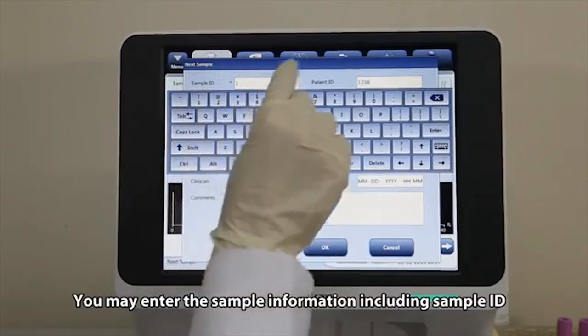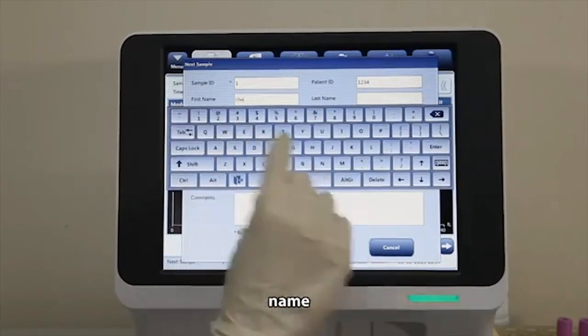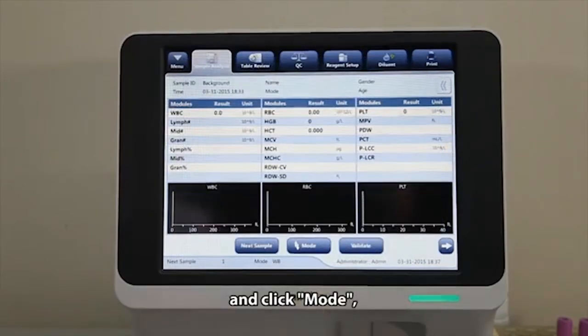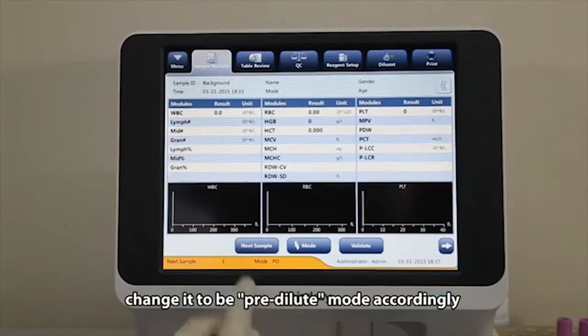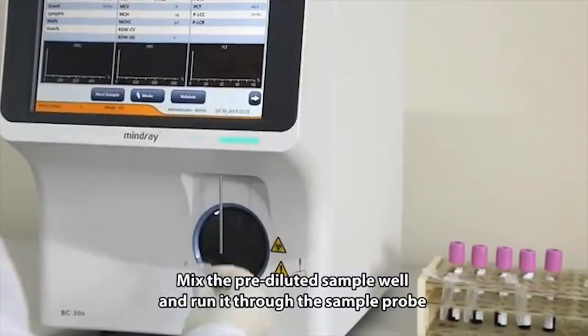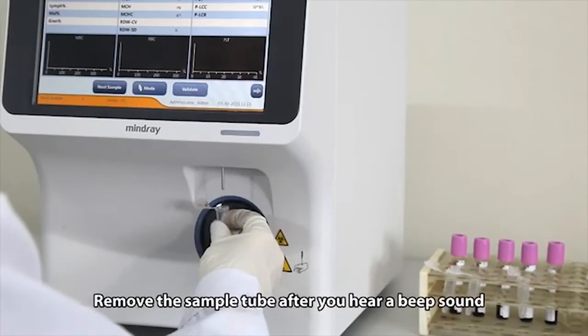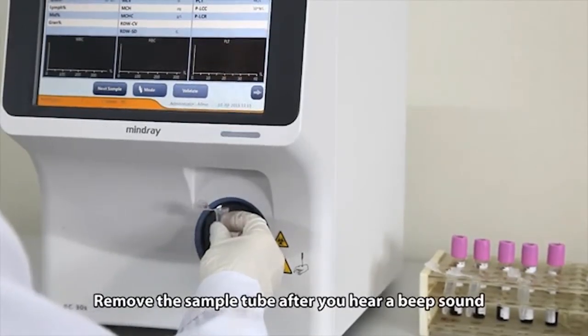You may enter the sample information, including sample ID, name, age, gender, and etc., and click mode. Change it to be pre-dilute mode accordingly. Mix the pre-diluted sample well and run it through the sample probe. Remove the sample tube after you hear a beep sound.